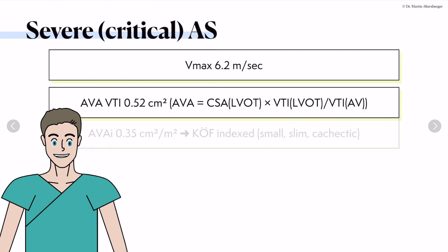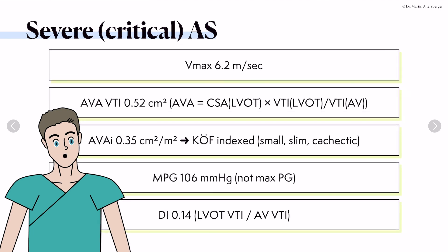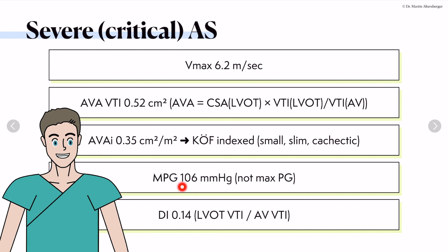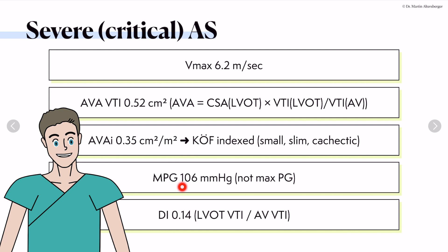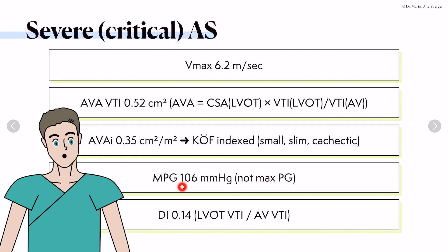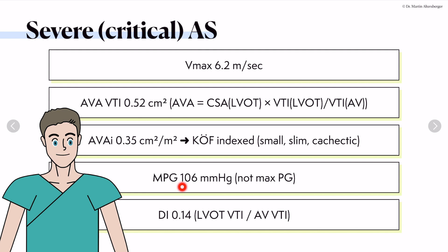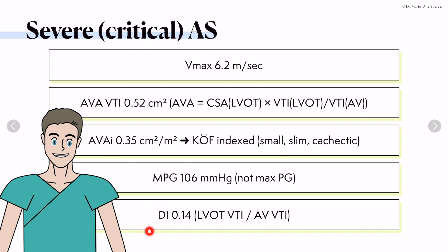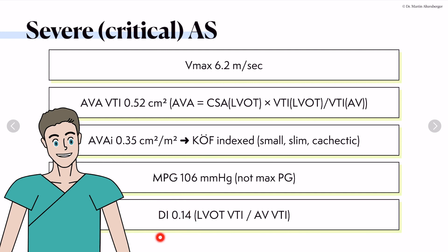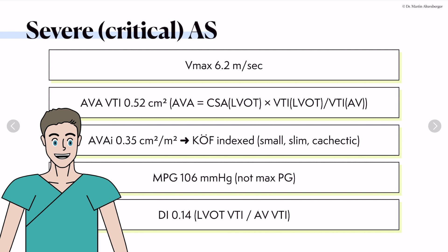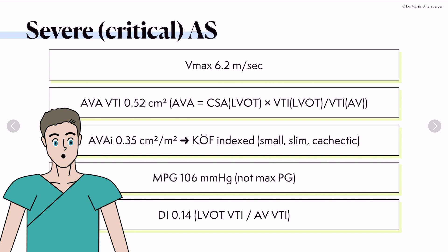So in this case, a severe or even critical aortic stenosis with a maximum velocity of 6.2 meters per second. The aortic valve area is 0.52 square centimeters, indexed at 0.35 square centimeters per square meter — body surface area indexed in a small and slim patient. The mean pressure gradient was 106 millimeters of mercury. The dimensionless index was also truly severely reduced at 0.14, where true severe stenosis starts at 0.25.